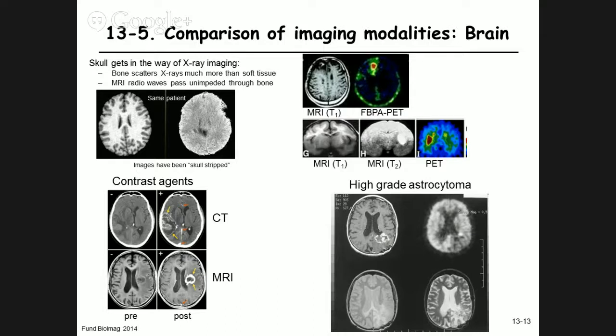So what could it be? Diffusion weighted image. Yes, in the early days they looked like that. Now they're crispier. So, what has low spatial resolution? Because that's one thing that we see here, low spatial resolution. It's one of the emission computed tomography techniques, be it PET or SPECT.